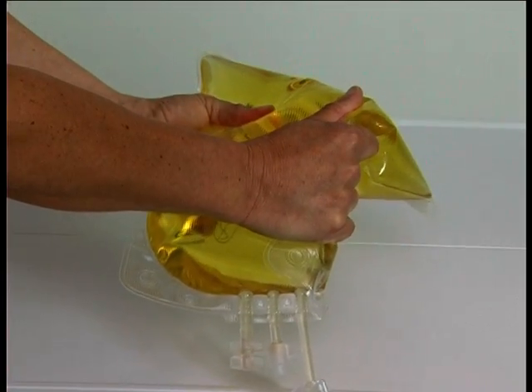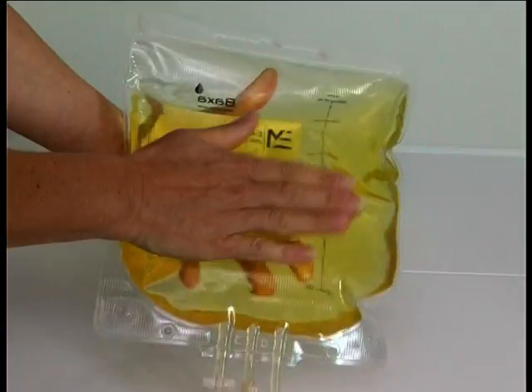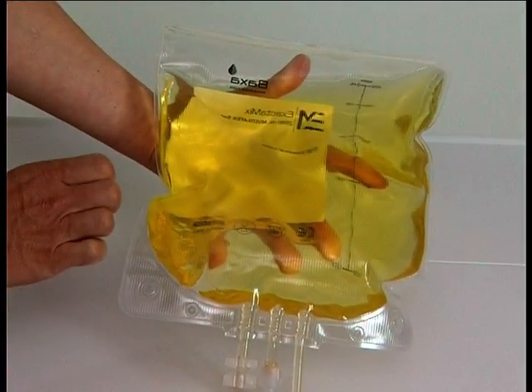Squeeze the bag to make sure that there are no small holes and tap to allow any small air bubbles in the fluid to come out into the top of the bag. This will help to avoid air in the line once the infusion is running.